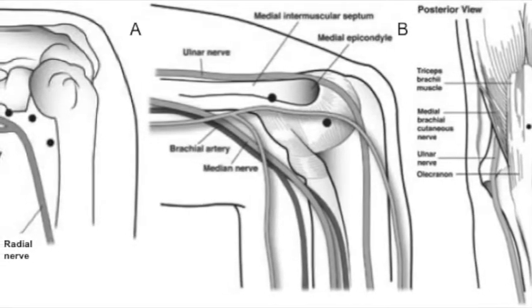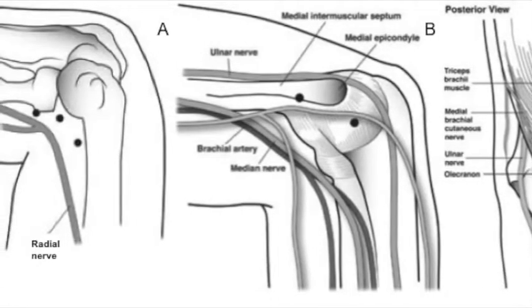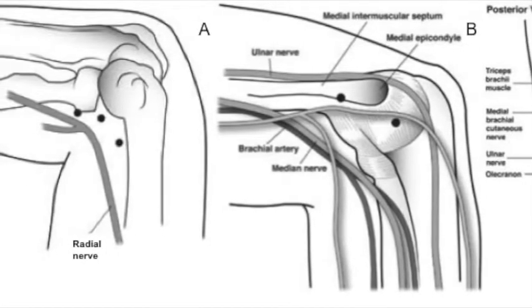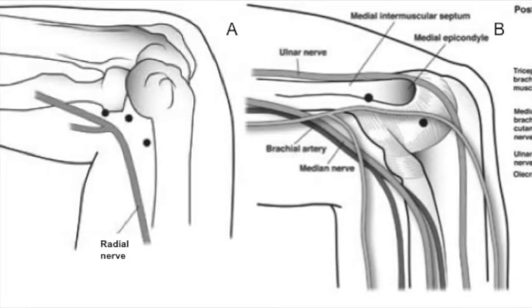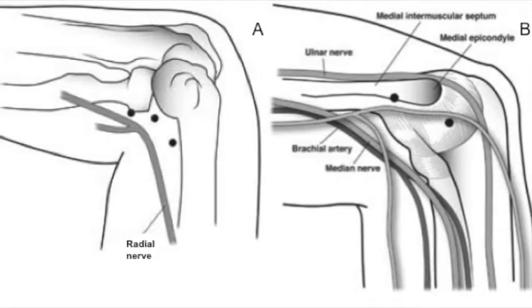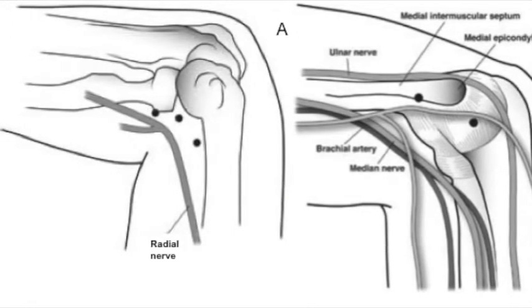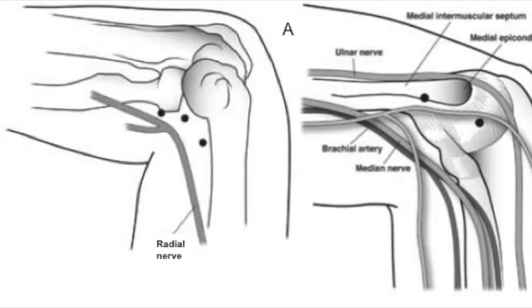The trocar should be slid along the anterior surface of the humerus, aimed towards the radial head. During this portal placement, the structure most at risk is the medial antebrachial cutaneous nerve. A 2.7 millimeter camera is then inserted via this portal, and the remaining distal, proximal, and anterolateral portals are created under direct vision as needed. Once proper visualization is achieved, the joint is inspected to determine whether an arthroscopic osteotomy would achieve the desired effect.